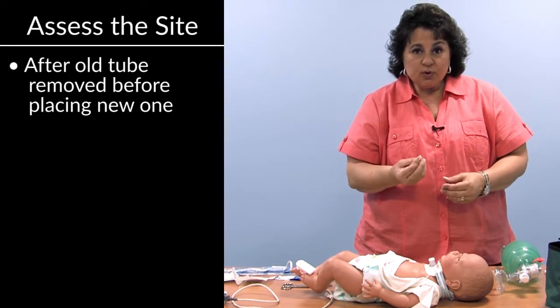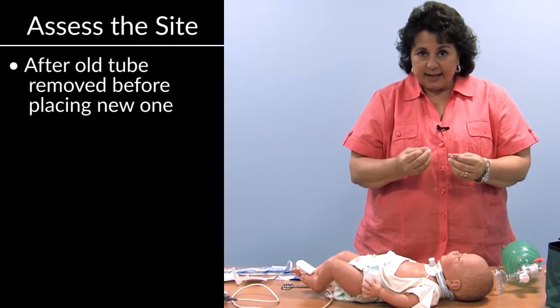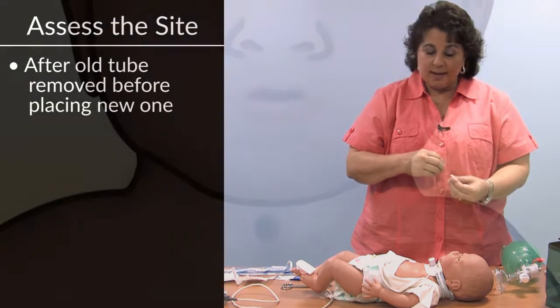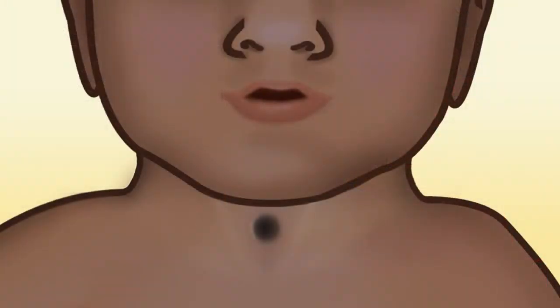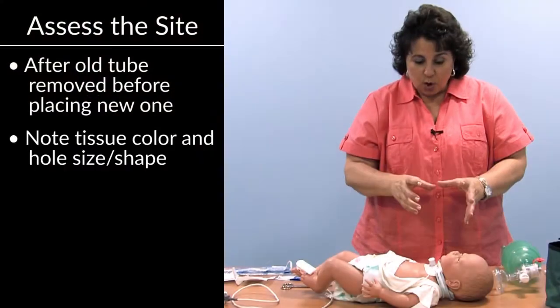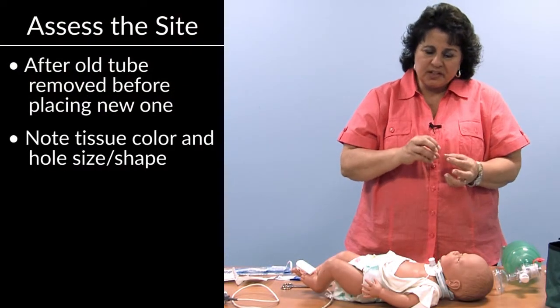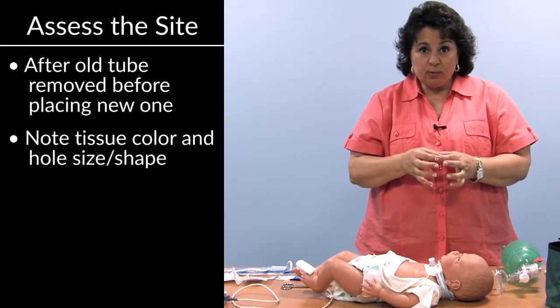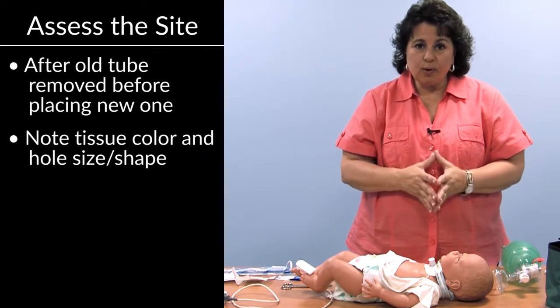When you remove the old tube, for those seconds that you have one tube out before the second new tube goes in, that's your opportunity to look at that stoma site. Think about it like a clock. Midnight, 6, 3, 9. Stare at that site, wipe it briskly, and notice if you see anything there. Red tissue, white tissue, perfectly round hole, egg-shaped hole, whatever it is you see, that's your moment to look.